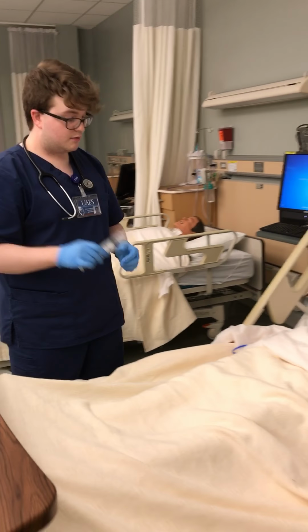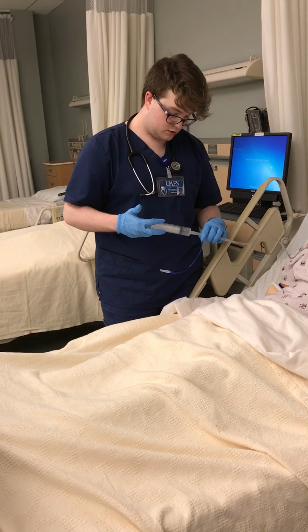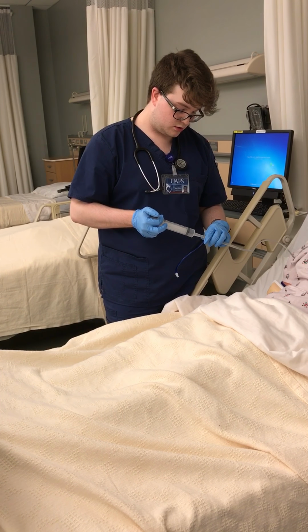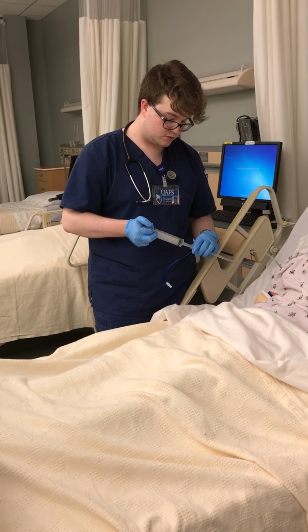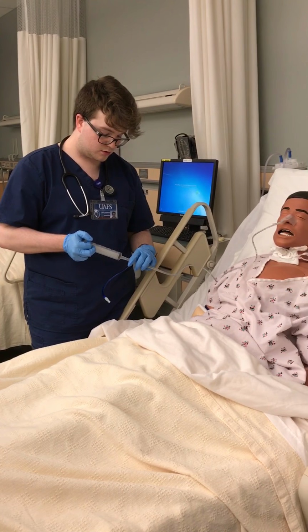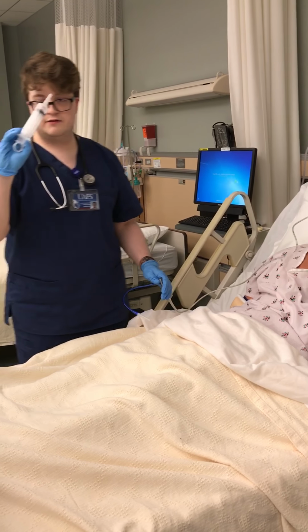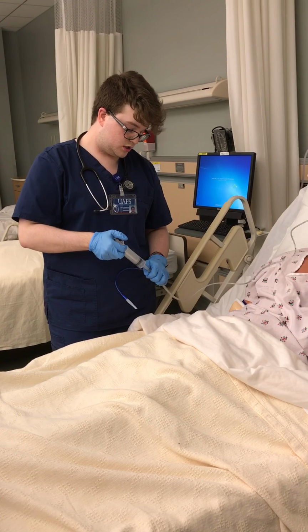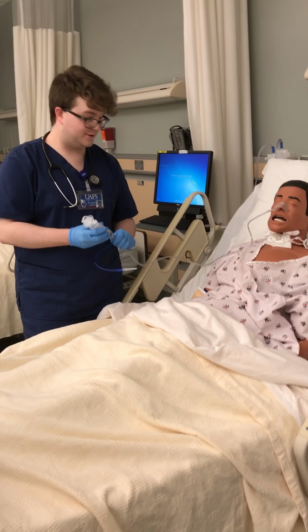Next thing I would do is administer the medication slowly. Okay, take that off. And then I would have my 15 milliliters of water already drawn up still. And insert that. Oh, we've gone slower than that, that's a little fast.